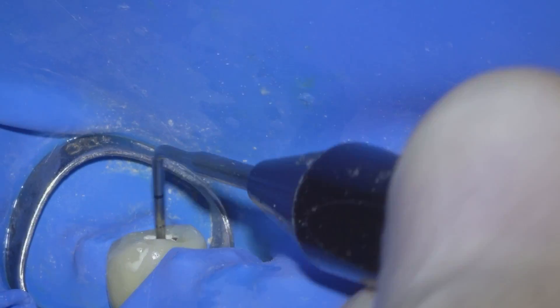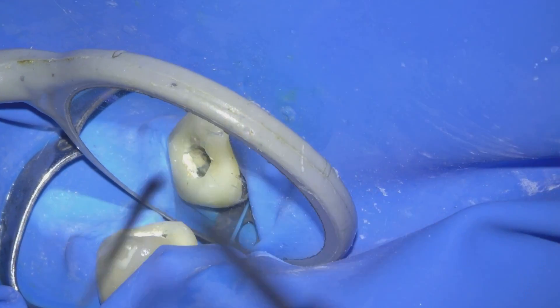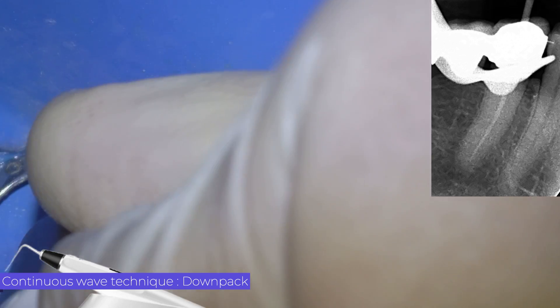Normally when we remove the heat plugger, the leftover gutta-percha comes with it. In this case it did not happen, because we did not choose the correct plugger. Here I perform a second down-pack and then proceed to the thermoplastic injection.